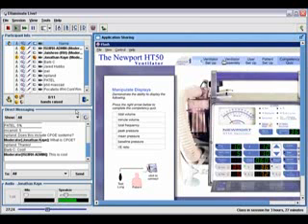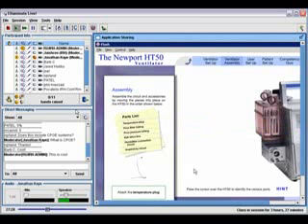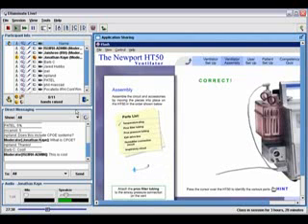I mentioned also in terms of assembly, kind of like with the physical procedure, this now is knowing where the parts go. You can get hints. You sort of piece it all together, and the point isn't to deprive them of all information and see if they sink or swim.